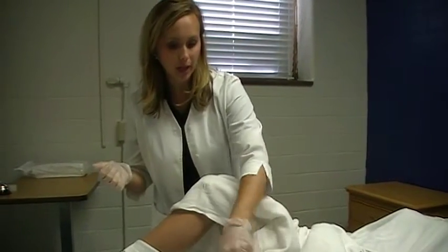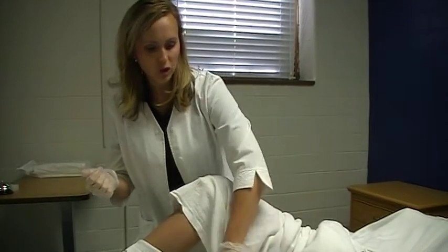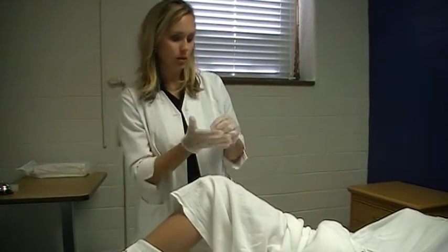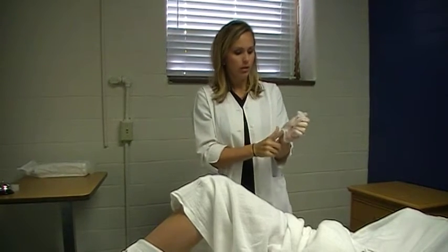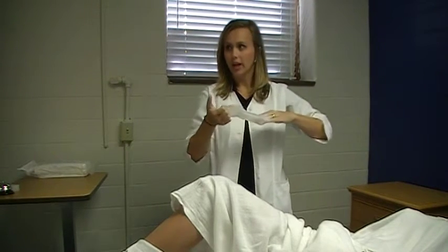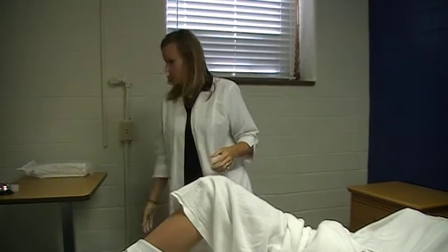Once peri care is completed, put the drape back down and take off your clean gloves — these are now considered dirty. Throw them in the trash, then go wash your hands. If you need to raise the rails to walk away from the bed, do that first.